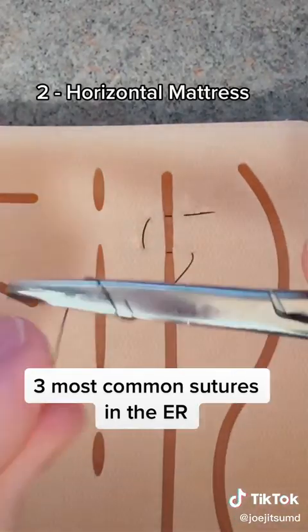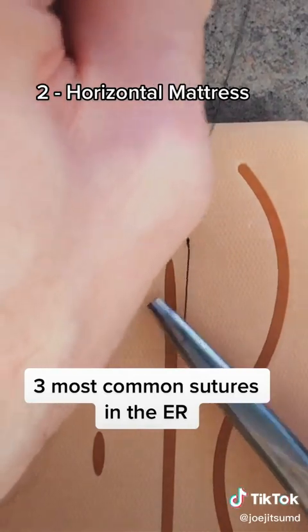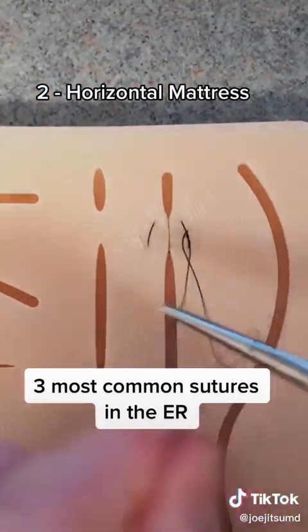Then using the same technique, 2 wraps around the needle driver to close the loop, followed by several subsequent 1-wrap knots on top for additional strength.